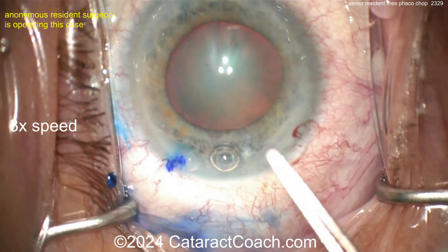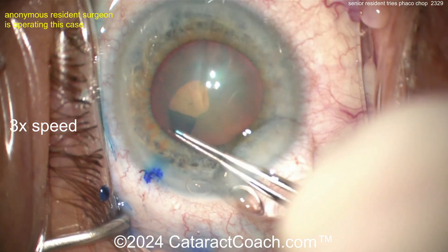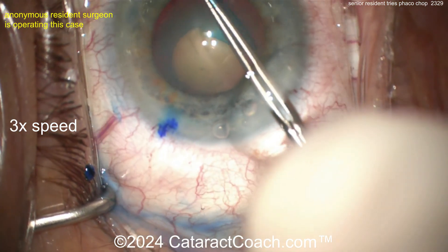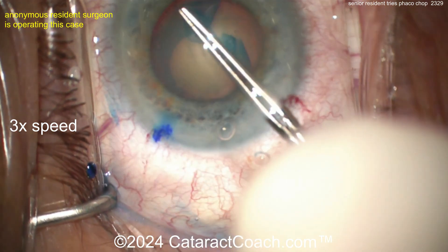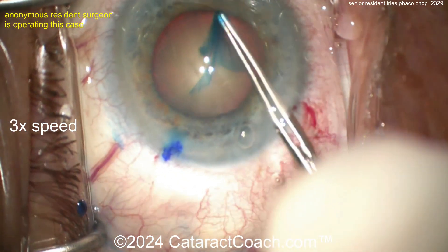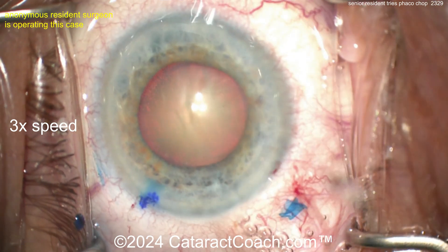We sped up the video to make it efficient for you. Poking in, grabbing that — no cystotome needed, I like that. In a case like this, don't make a baby rhexis. Keep it big, keep it big — beautiful! That is a really good-looking rhexis.